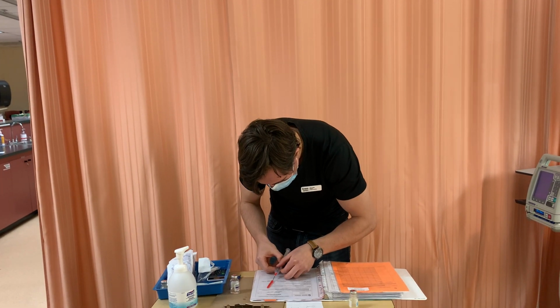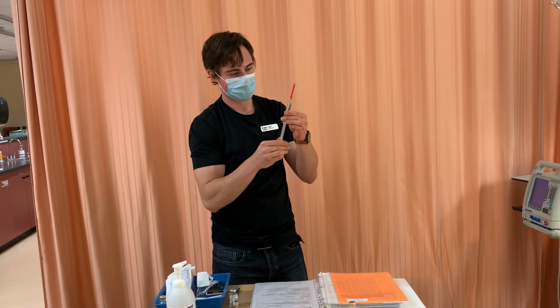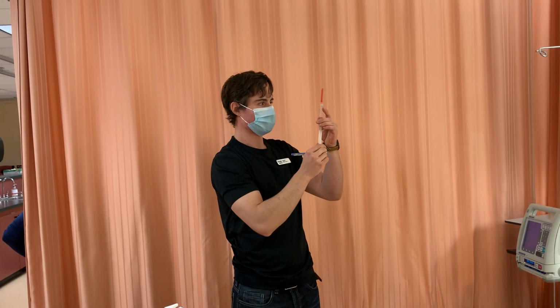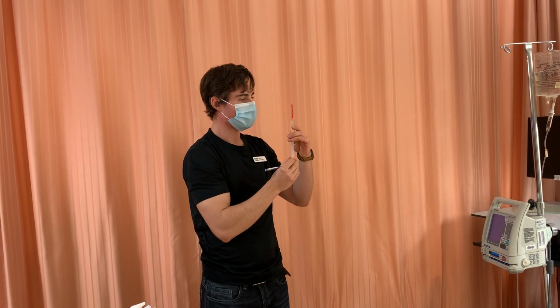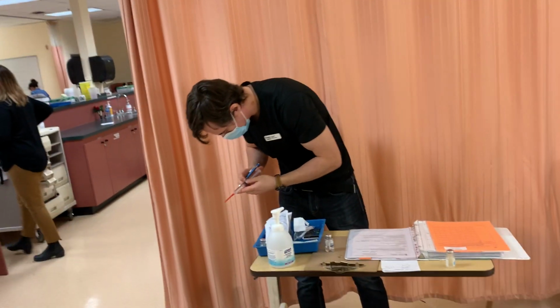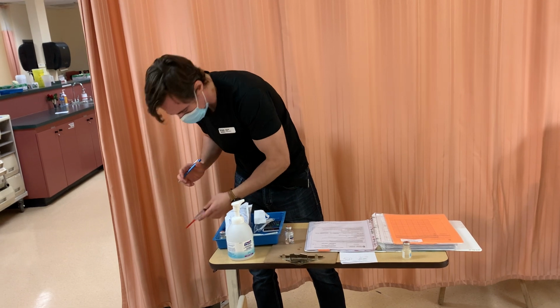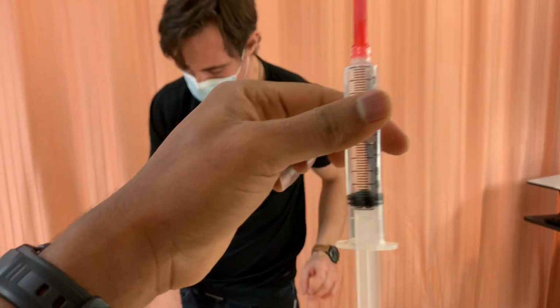Do our scoop method. I'm going to clean for 30 seconds. Wait for 15 to dry. Make sure that there's no bubbles in there. I'm going to do this at mid-waist. Get to the 10 ml. And here we have our 10 ml of medication.